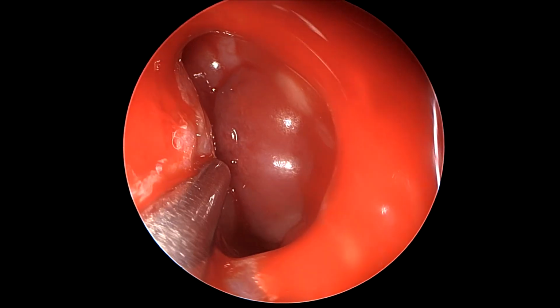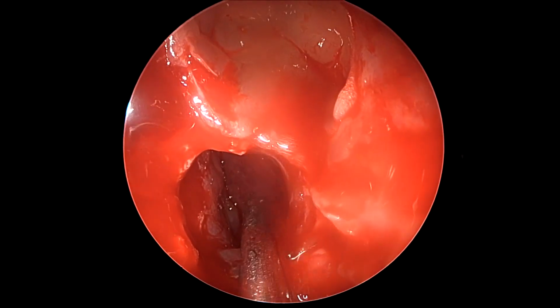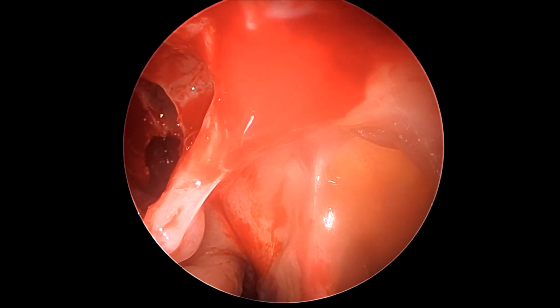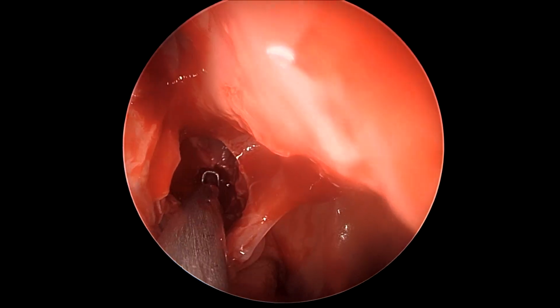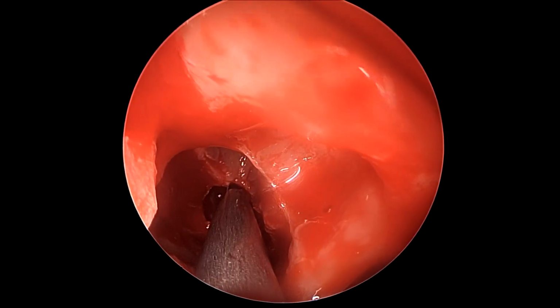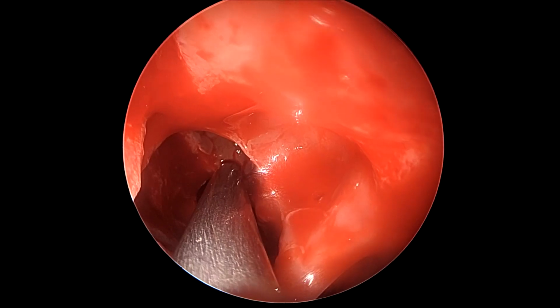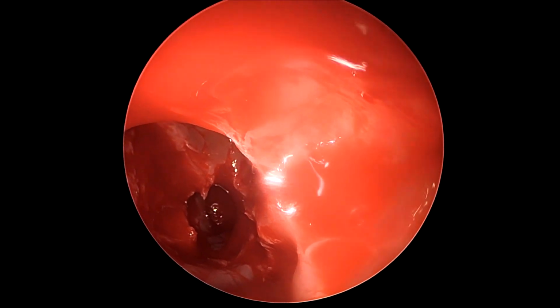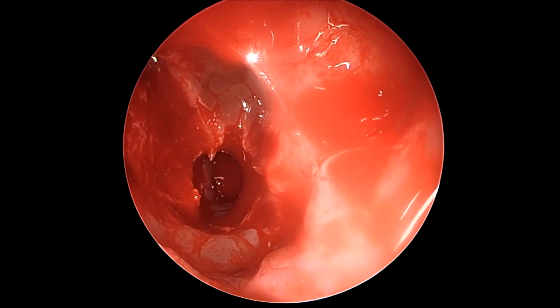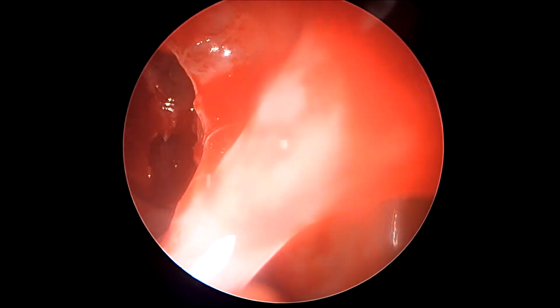Now, as we see here, the sphenoid has been opened on the left side, happens to be quite clear, and one can see how the ethmoid septations still remain after the first surgery, which would need to be cleared for us to be giving this patient a canal wall down kind of an approach that we take in ear surgeries to create a very wide area for both examination and irrigation.